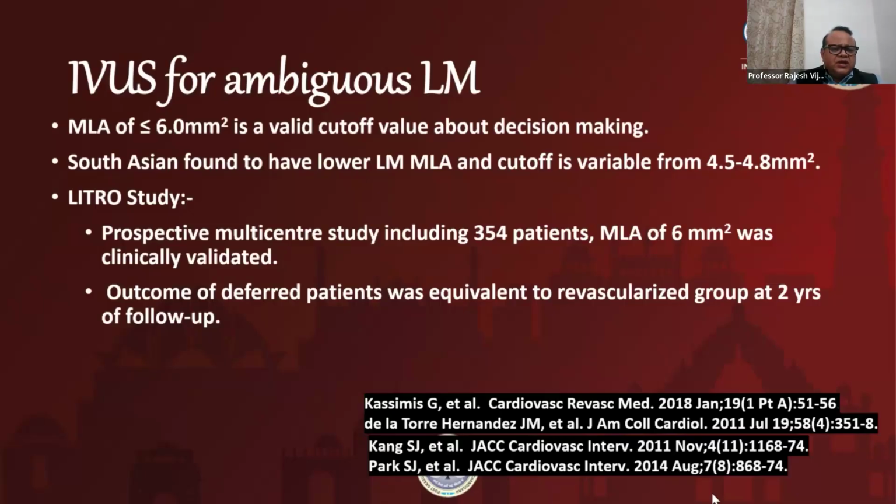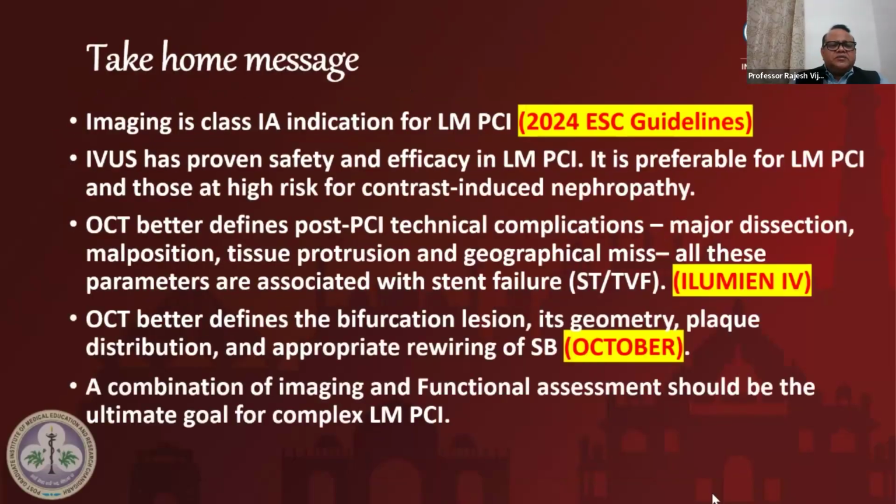revascularization. A study from the European countries has been published, which is a prospective multicentric study involving 354 patients, and this is the MLA of 6 millimeter square, which was clinically validated and had 2 years of follow-up. The outcome in those who were revascularized versus those who were deferred was similar. So finally, imaging is a class 1 indication for left main PCI as per the ESC guideline.